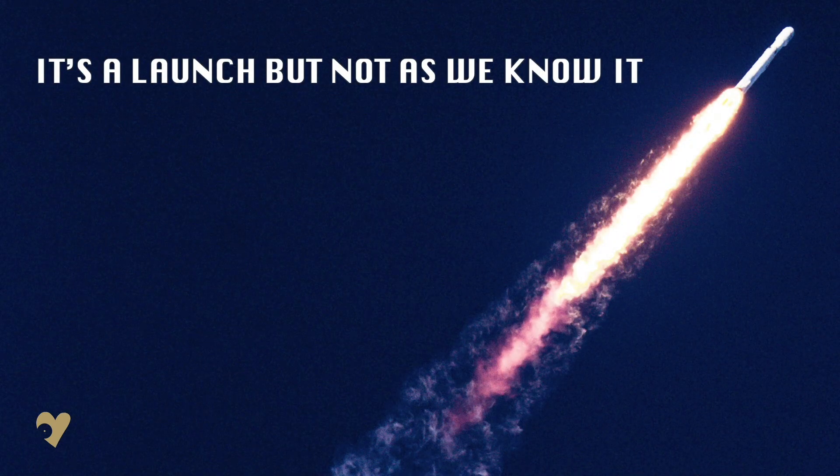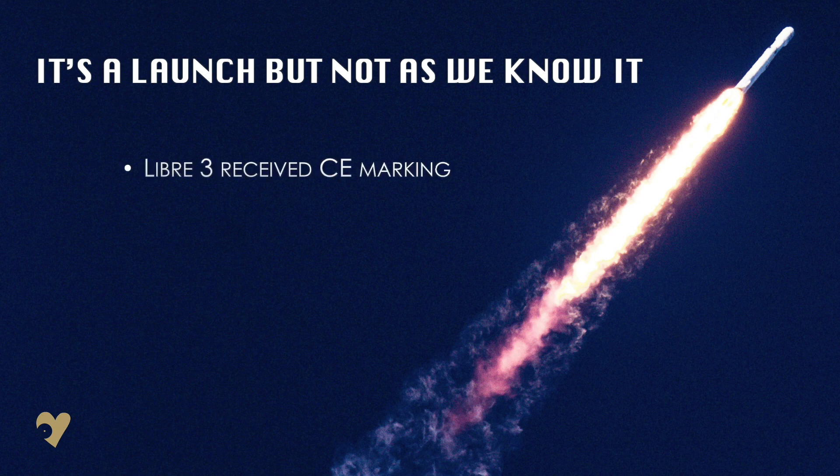Last month, Abbott announced that the Libre 3 has received a CE marking. This means that it meets all the EU requirements and is set to launch in some European countries in the near future.